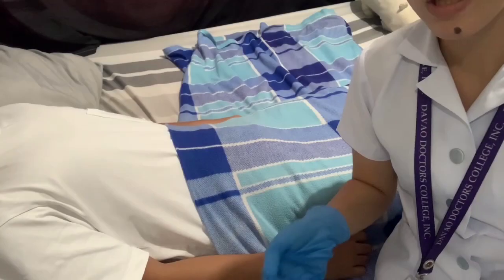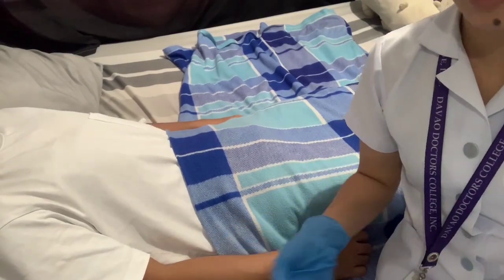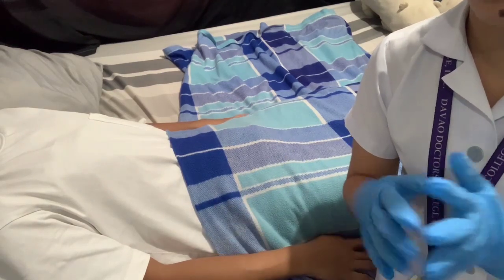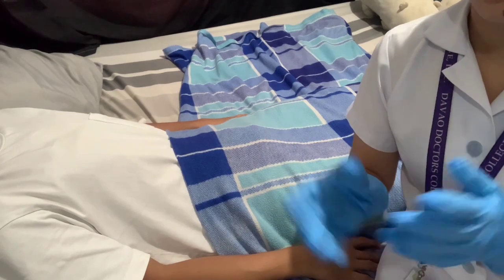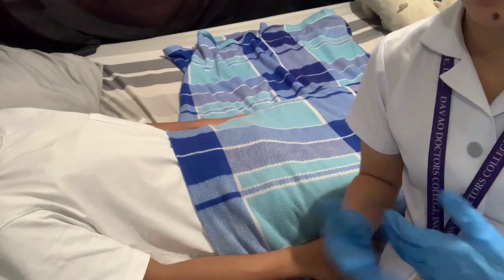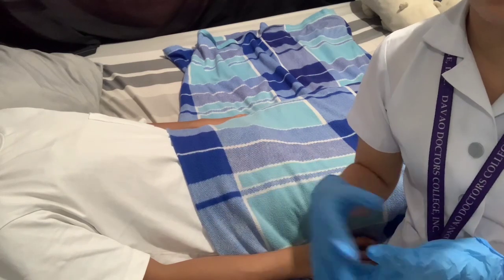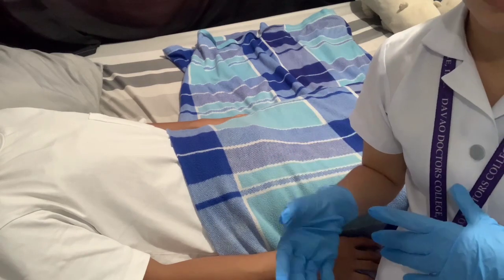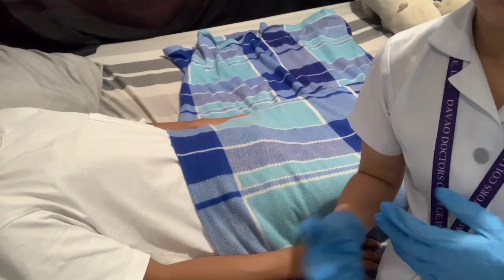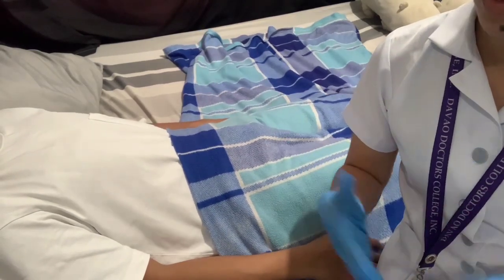So as we have already selected a site, we are going to clean this after. So we have to make sure that the site is free of tenderness, hardness, swelling, scarring, itching, burning, or even localized inflammation. So we are going to select a site that has not been frequently used, and now we are going to start cleaning the center of the site, widening the circle inward to outward.